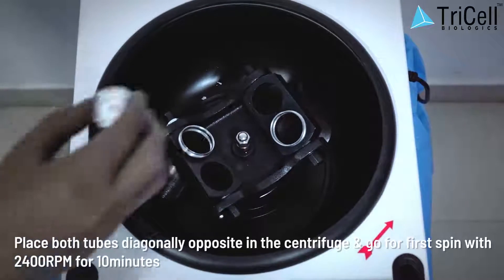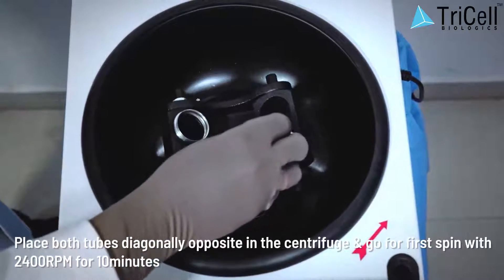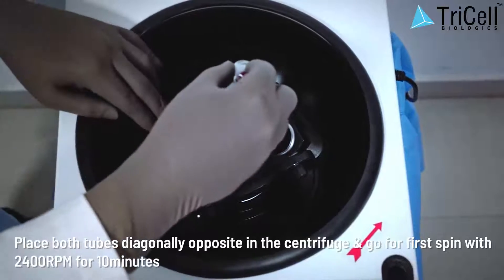Step 5: Place both tubes diagonally opposite in the centrifuge and go for the first spin at 2400 RPM for 10 minutes.